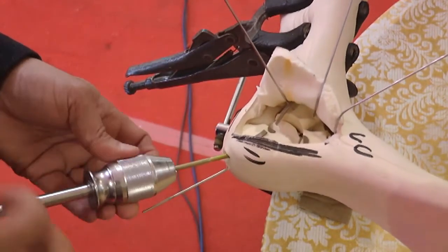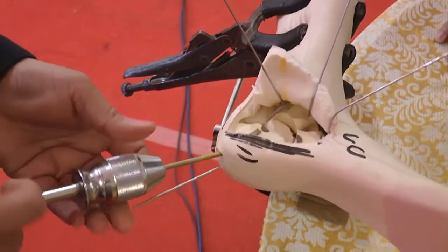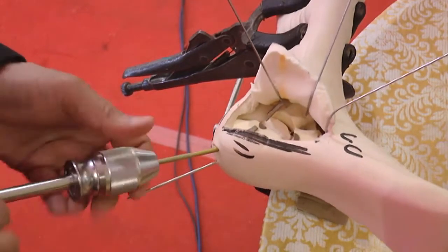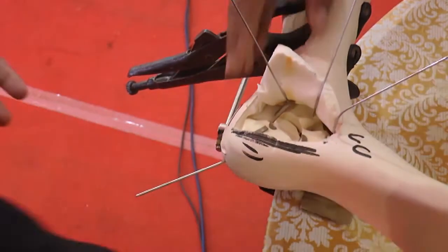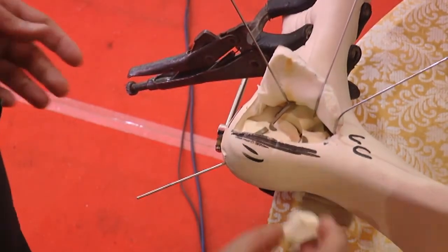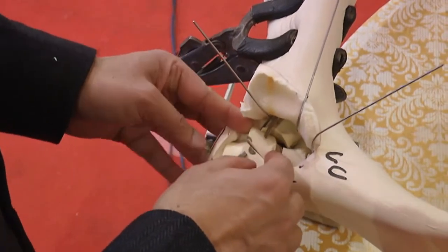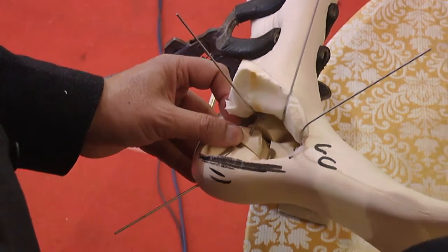So this is now reduced to the medial wall, and the next step will be to lift up your lateral fragment, the lateral depressed fragment. So this was a fragment which was lying like this. So now you have made the space. So what you do is to take a blunt instrument.